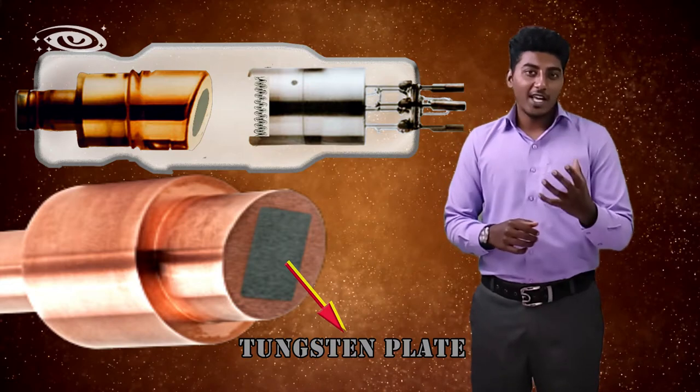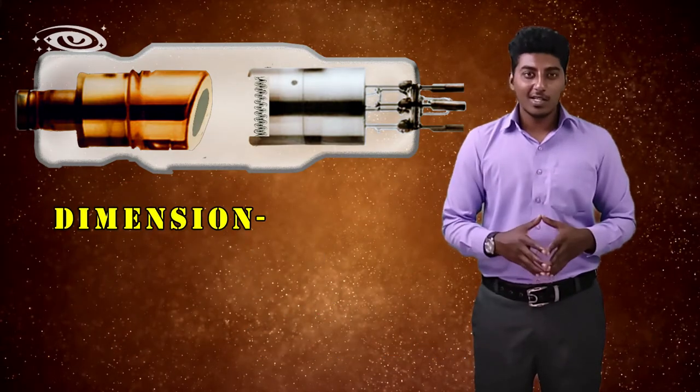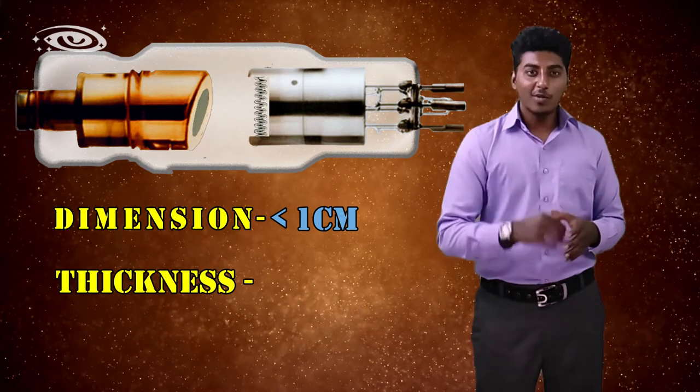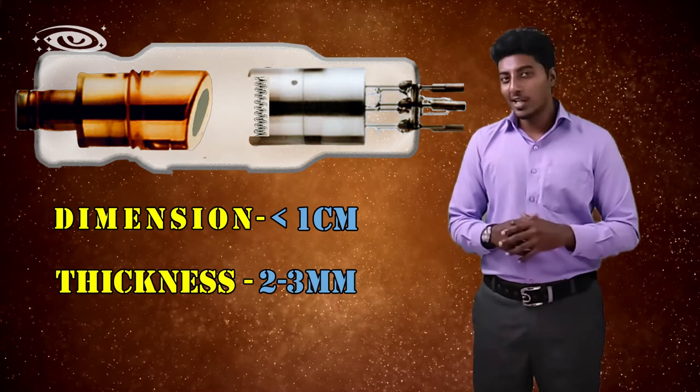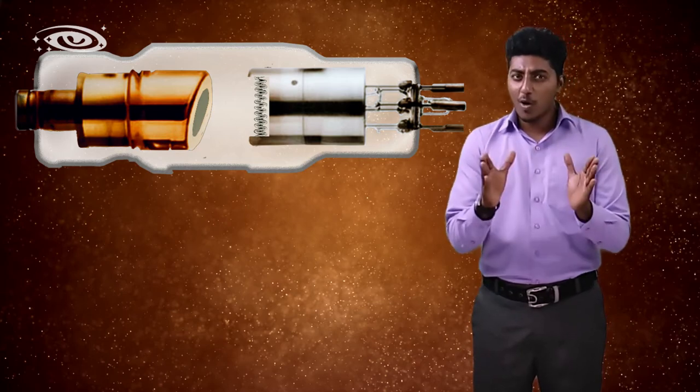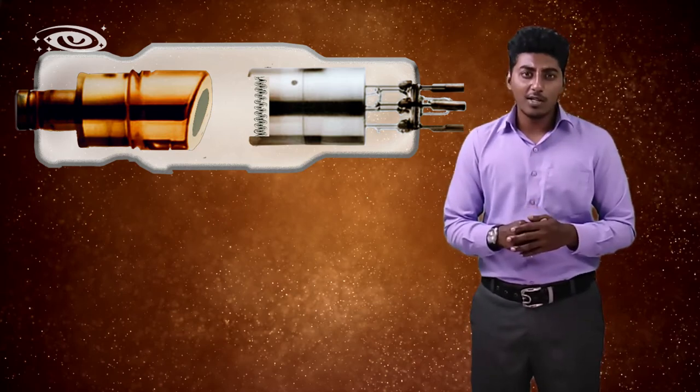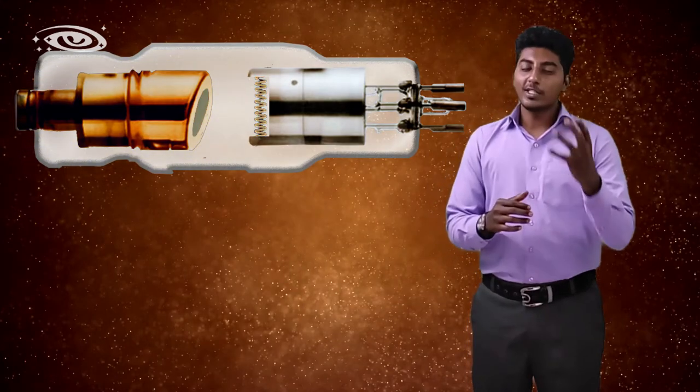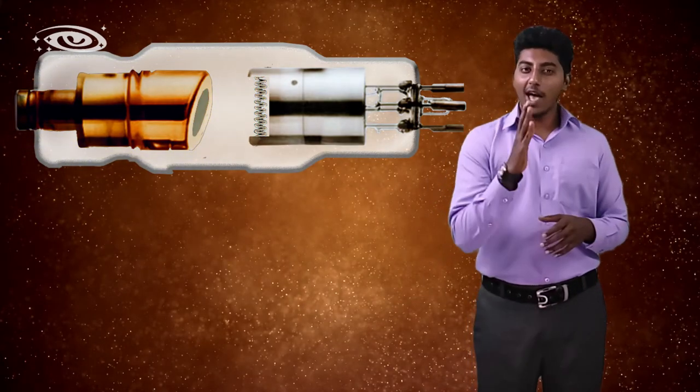The dimension of the tungsten plate is more than one centimeter, and the thickness is two to three millimeter. This tungsten plate is embedded with the copper block. The use of copper block is it can dissipate heat immediately, so the tube life will be increased.